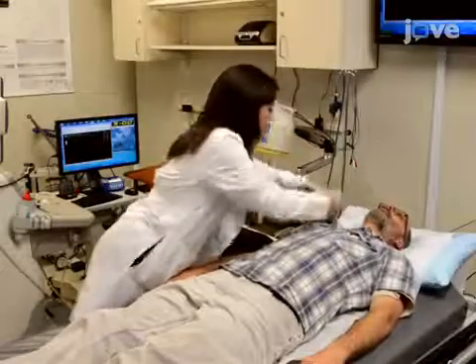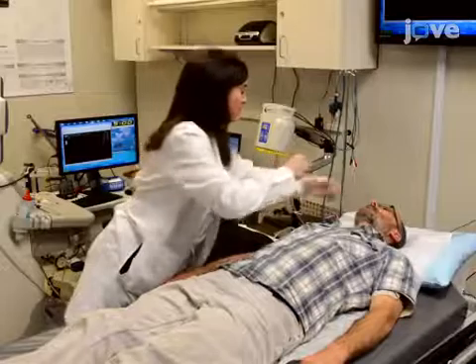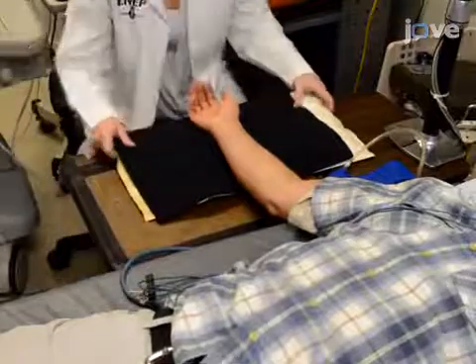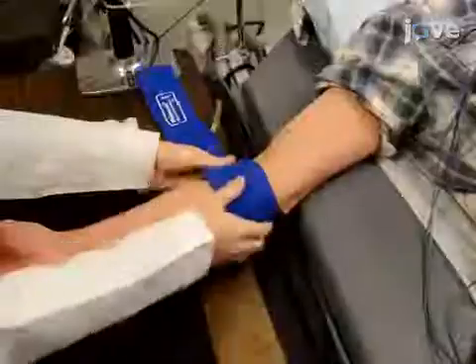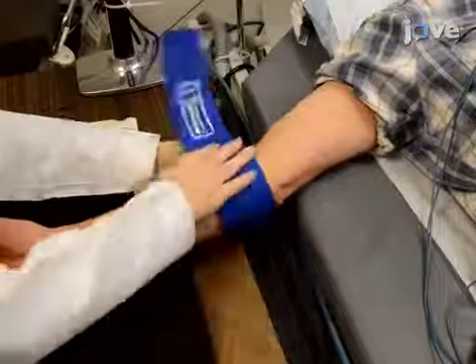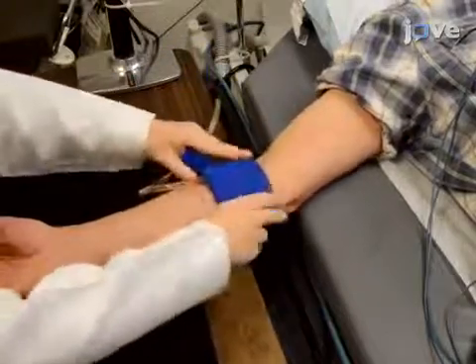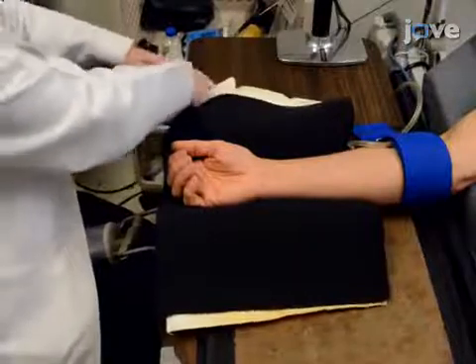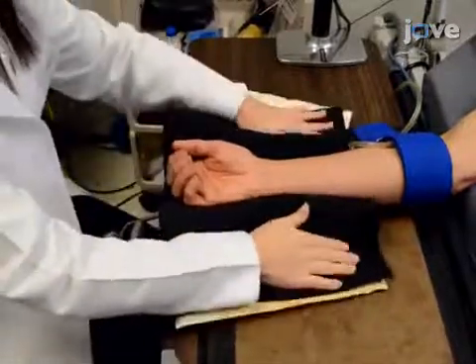Next, attach a 3-lead ECG in the standard limb lead 2 position, and then extend the subject's arm laterally to about 80 degrees of shoulder abduction. Place the forearm cuff immediately distal to the medial epicondyle, and secure the distal forearm in a vacuum-packed pillow to maintain the arm in the appropriate position during the measurement.